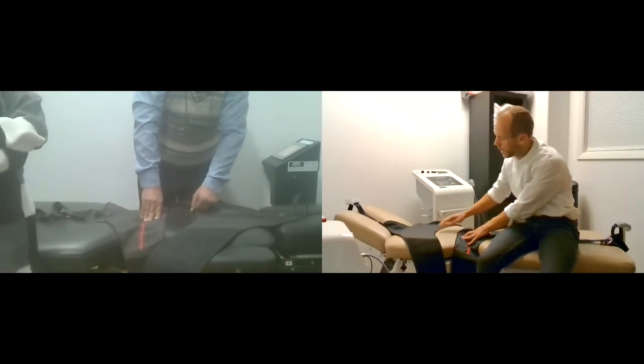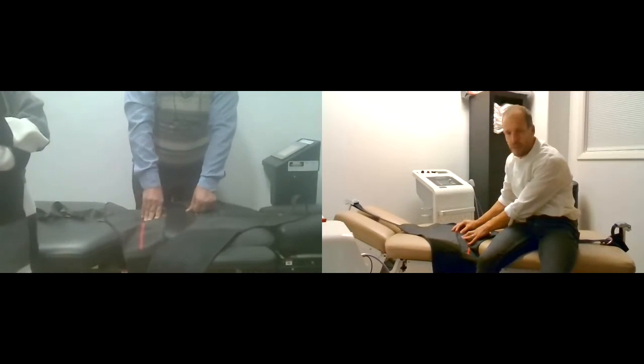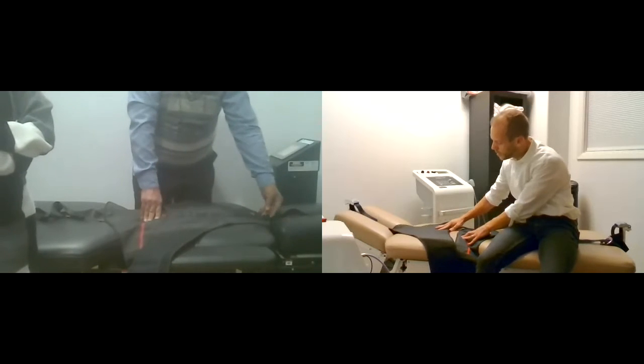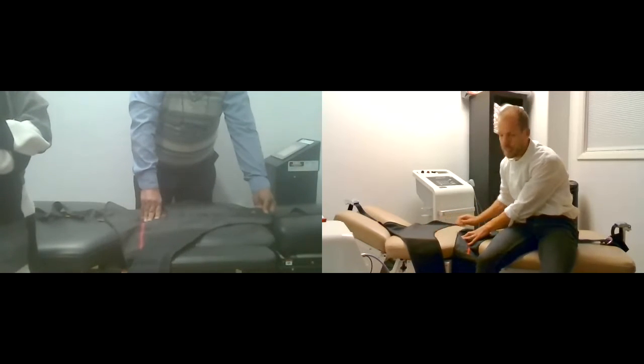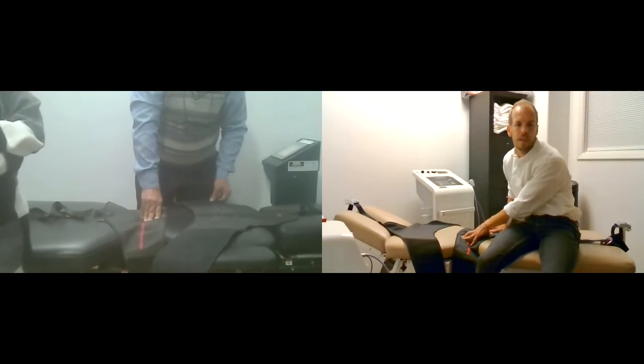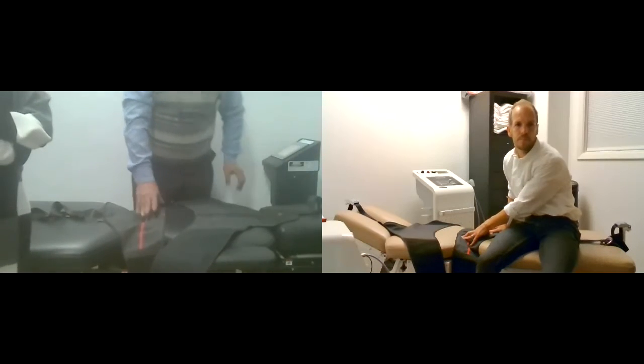So again, you're going to be anywhere from completely touching for your shortest patient up to about 5 to 6 inches for your very tallest patient.